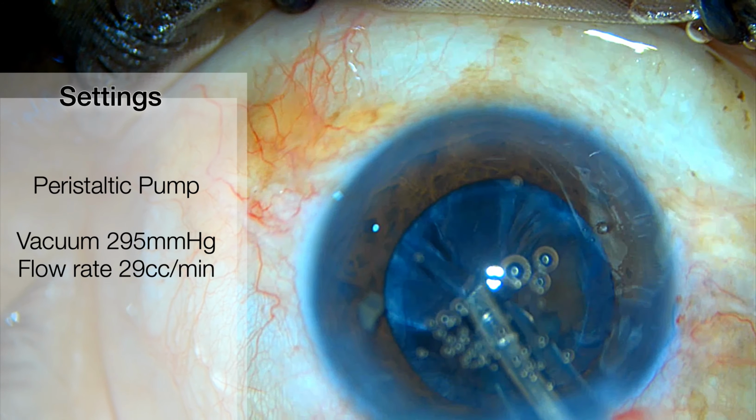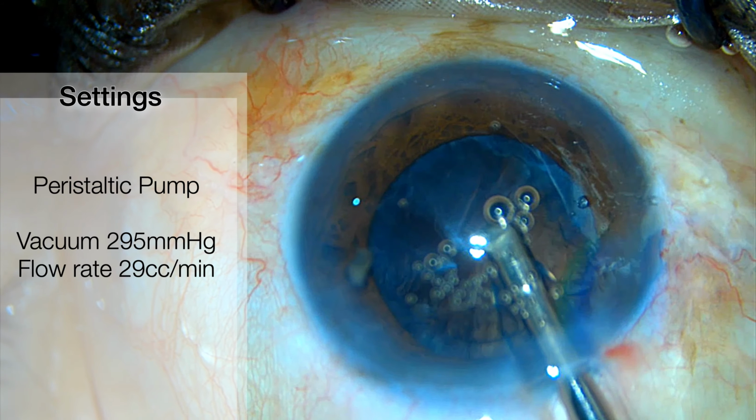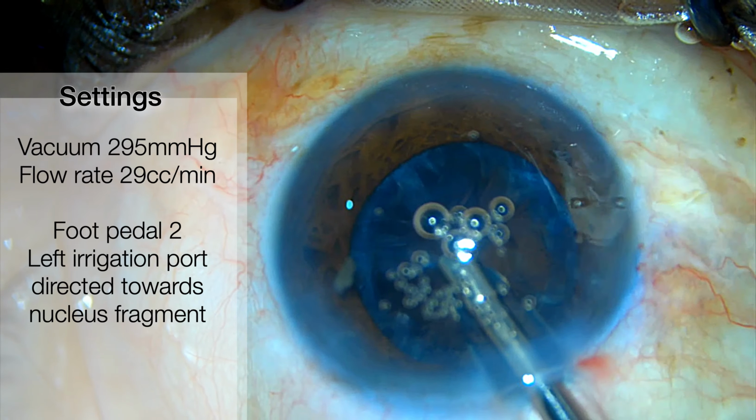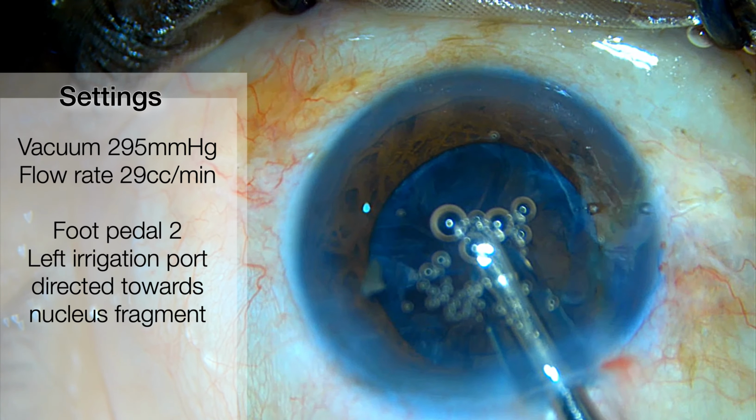So here you can see that this is a peristaltic machine. Vacuum is already set to 295 and the flow rate is set to 29. I'm in position 2, the irrigation ports are directed towards the nucleus piece, but the piece doesn't seem to want to move towards the probe.